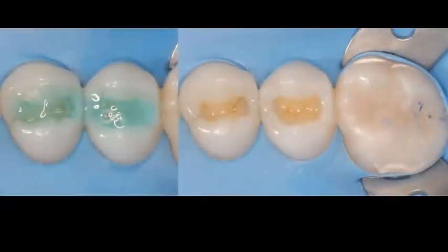So in this particular case, and again, we've spoken a lot about this throughout the year about different bonding techniques. So we have a webinar only on bonding agents that I would highly recommend that you watch if you haven't done so. But here we decided for good reasons to do a total etch technique. So you can see we're removing all the smear layer. We're creating the right environment on the enamel. We etch the enamel for 10 to 15 seconds, no more than 10 seconds the dentin, and then we rinse thoroughly. We do not bone dry. We allow that dentin to be slightly moist, and then we're going to go ahead and we apply our adhesive.